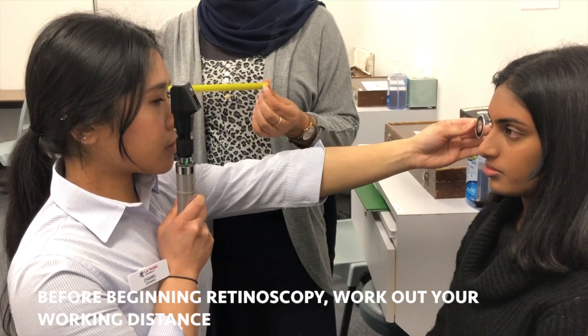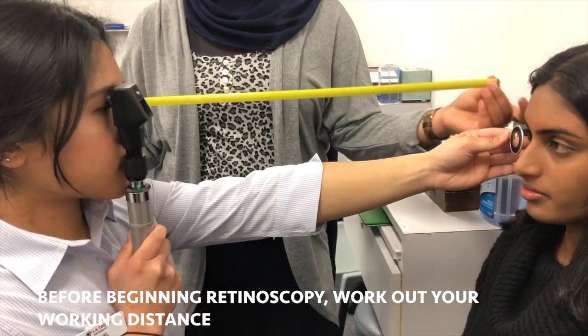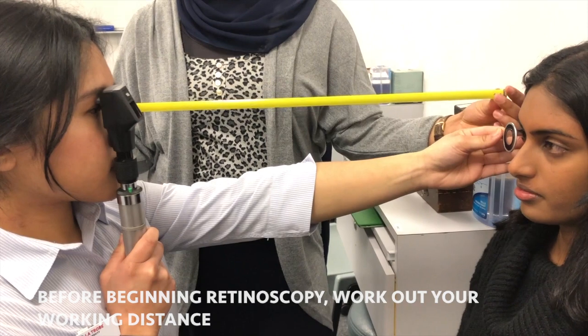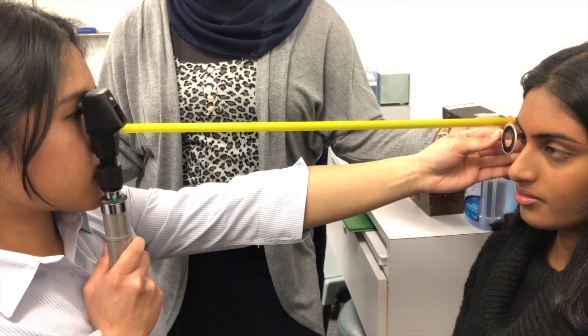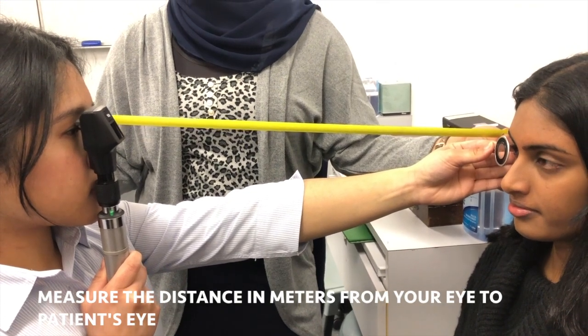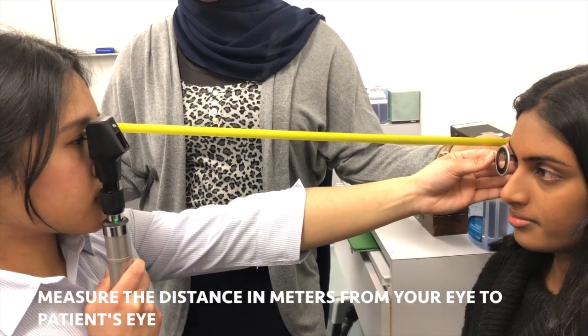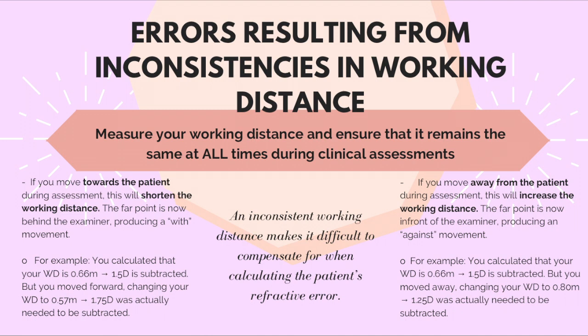While doing retinoscopy, you must measure your working distance. Your working distance varies from person to person, so you must measure your own distance. Pretend that you are assessing someone whilst holding a correcting lens in front of them. Using a tape measure, measure the distance in meters from your eye to the patient's eye. Ensure that it remains the same at all times during clinical assessments.